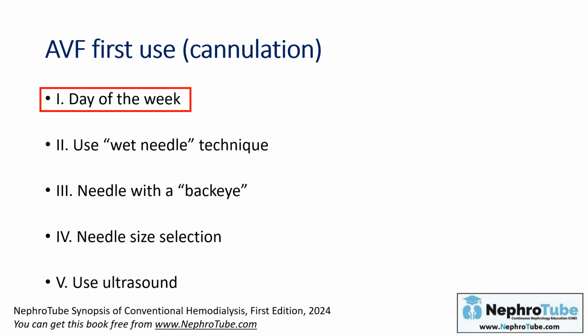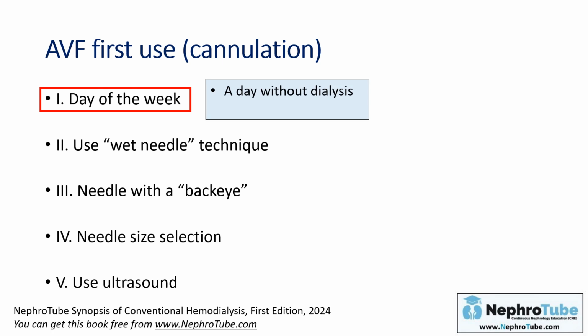First, day of the week. It's better to cannulate the fistula on a day without dialysis. This helps to avoid any heparin-related complications, heparin that is used for anticoagulation during the hemodialysis session itself.